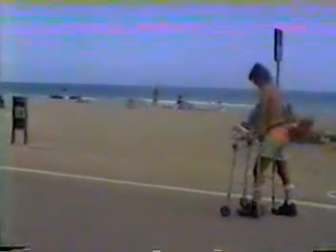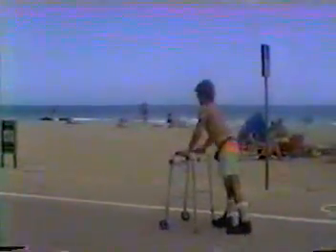Average walking distances for a single walk after 33 training sessions over 3 months are 350 feet per walk. That is for training sessions that are held 3 times a week. When training sessions are held daily, then after 4 months of daily training of an hour and a half a day, average walking distances were reported to be 1,500 feet. That is 4 times as much as before, nearly 5 times as much.